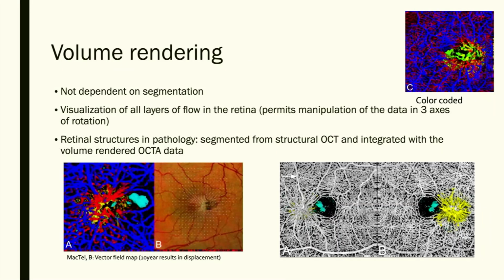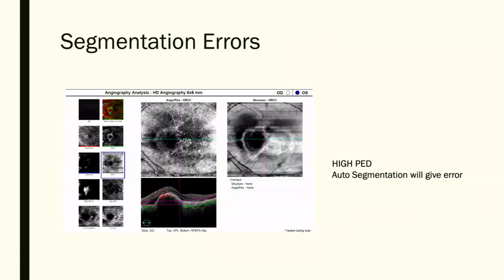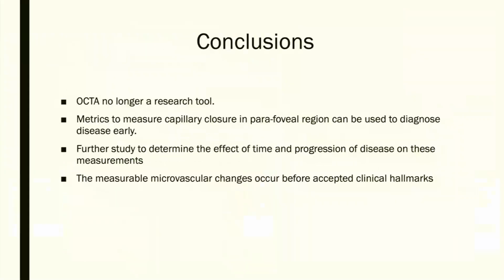When you don't know whether your segmentation lines are correct or not, see this top corner image. This is a combination of superficial and deep, and gives you everything together, so you will be able to pick up anything in any of these layers without trying to separate which layer it is.